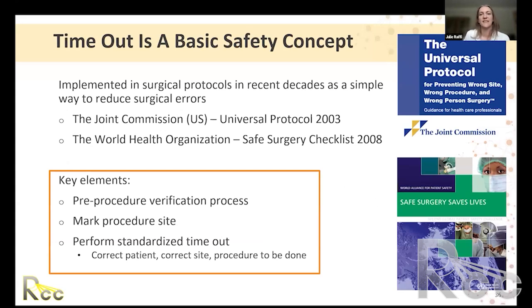All right, timing out before treatment. This is a basic safety concept that comes from surgical procedures. It has been implemented in surgery for the past couple of decades to reduce simple errors such as performing surgery on the wrong site, performing the wrong procedure, or treating the wrong patient.